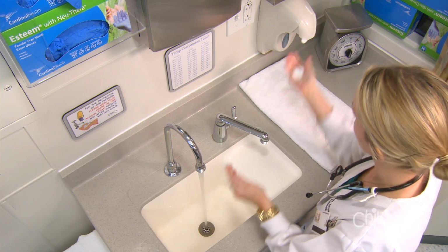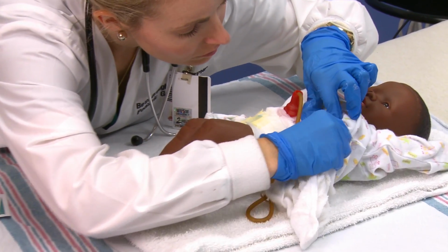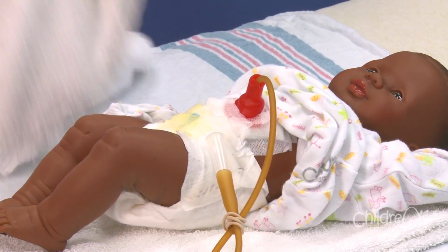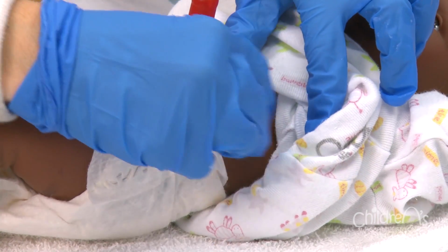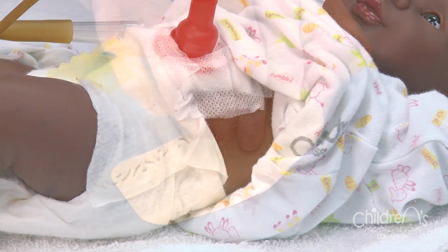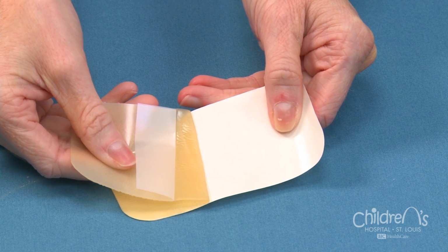Wash your hands. Clean and dry the area on your child's abdomen where you will tape the G-tube. Wipe a skin prep pad on the skin where the tape will go. If your child's skin is irritated, your surgery team may order a special dressing, known as Duoderm.